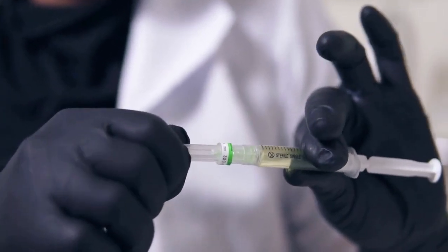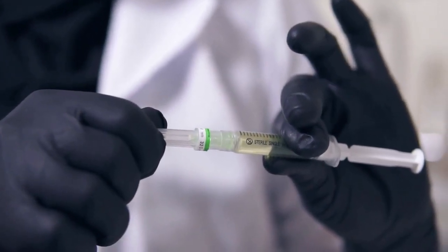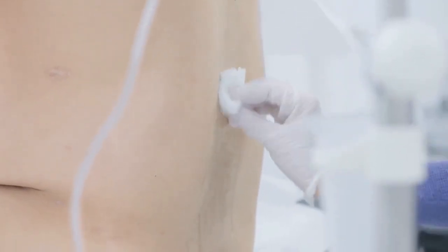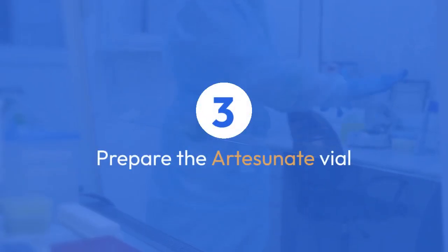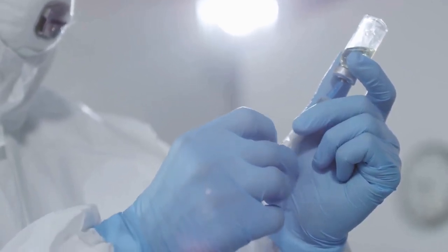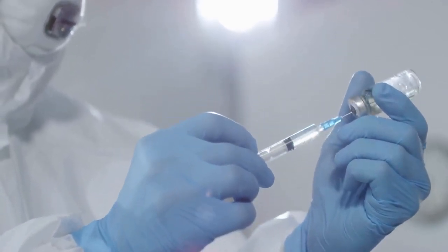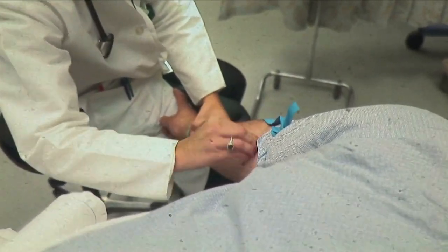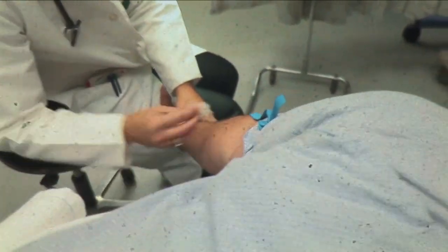Step 2: Prepare the injection site. Clean the area where you'll be injecting the artesanate with an alcohol swab and let it dry completely. Step 3: Prepare the artesanate vial. Carefully inspect the vial for any damage, discoloration, or particulate matter. If anything seems amiss, do not use it. Clean the top of the vial with an alcohol swab.